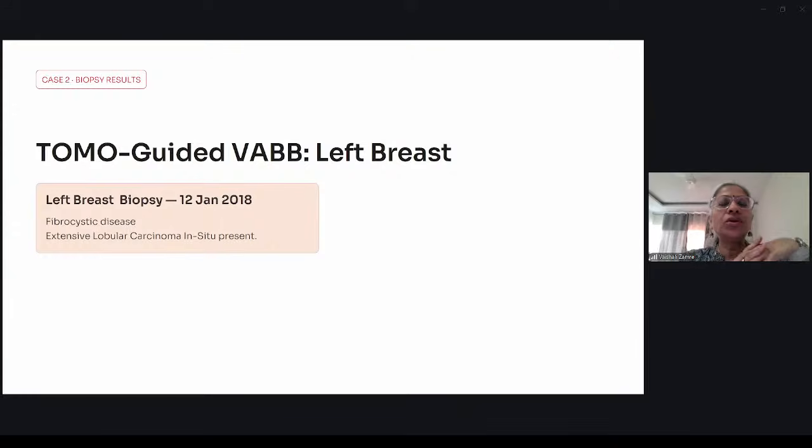Okay. So, Dr. Twisha, what was the indication of putting a clip? Can you tell us, for the sake of the audience? So the clip here marks the location of the cancer. After the lesion is excised using VAB, we still know where the lesion was present, and depending on the biopsy report, we'll go ahead with further treatment, if the patient needs any radiotherapy.